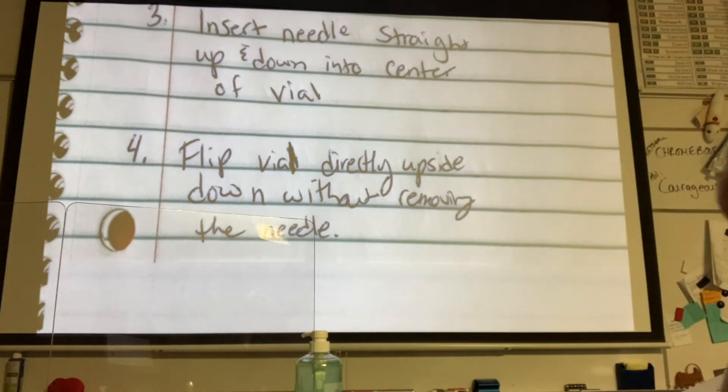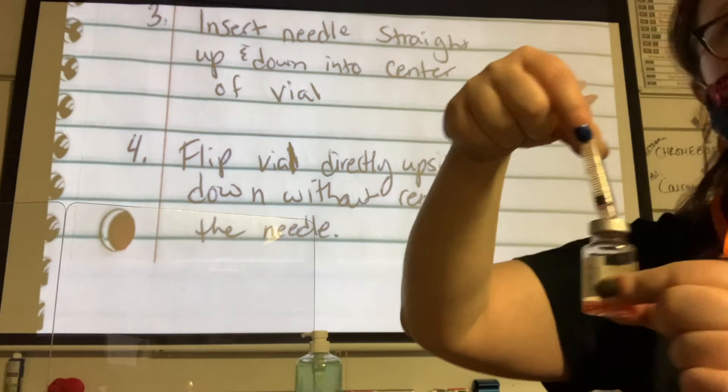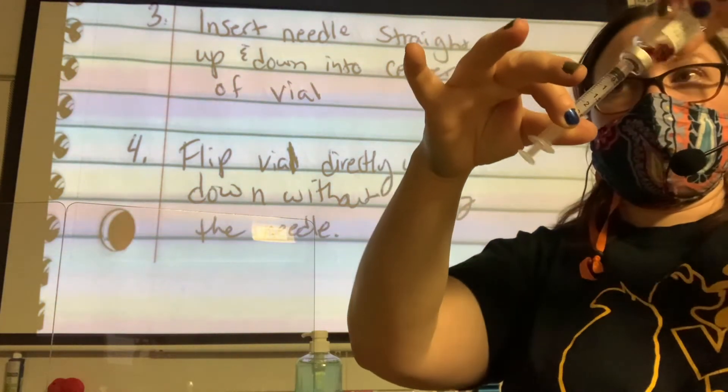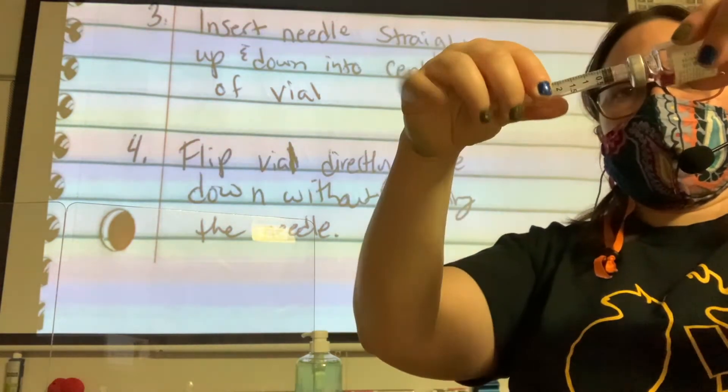So we're going to use our plunger as the axis. So I can rotate things and they rotate on an axis. So I am going to lightly hold it. I'm going to allow that syringe to move. See how I have a lighter grip on it than I did when I first inserted it. So now when I move it, the syringe is moving like a pendulum. So that's how I'm moving it. I'm allowing that syringe to move. The bottle is pretty stable. My hand rotates on my bottle and comes up on an angle. What ends up happening is you do this all at once. So you just go boom, boom. And it's like, oh my gosh, what just happened? How did you do that?